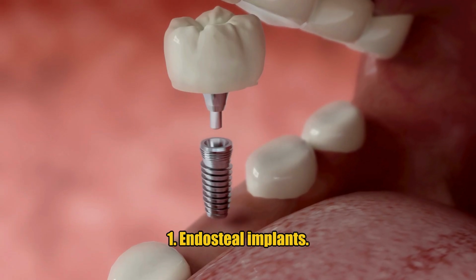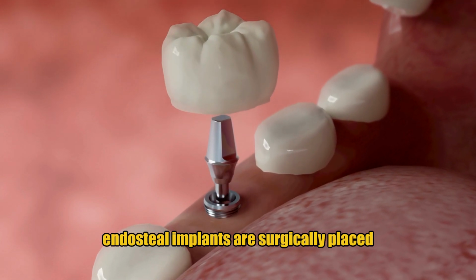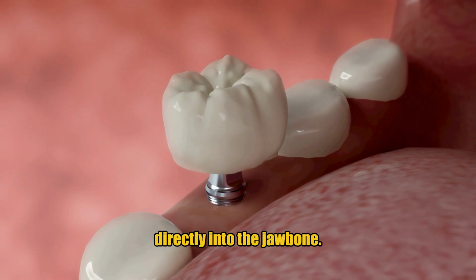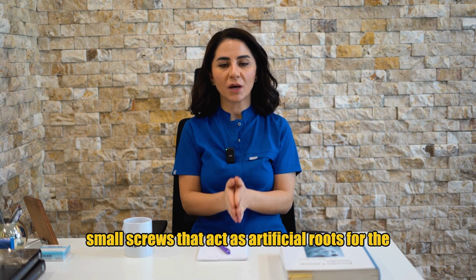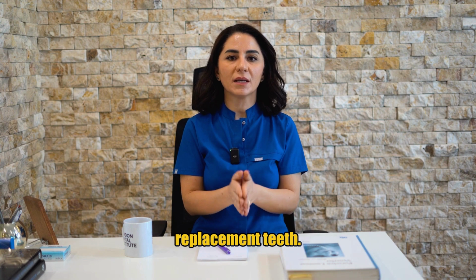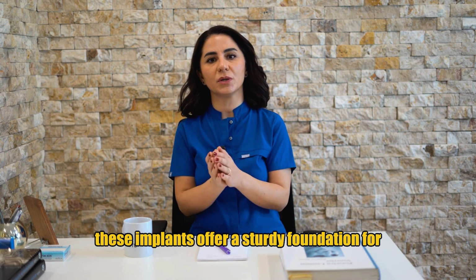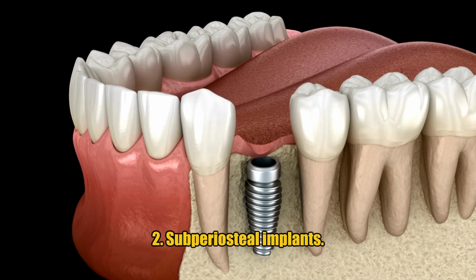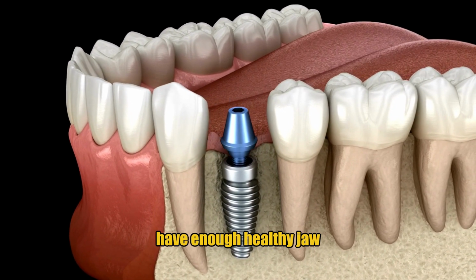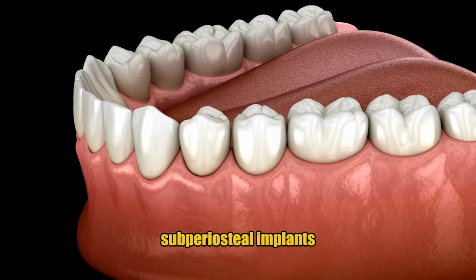1. Endosteal implants. As the most common type of dental implant, endosteal implants are surgically placed directly into the jawbone. They typically consist of titanium and resemble small screws that act as artificial roots for the replacement teeth. Ideal for patients with sufficient bone height, these implants offer a sturdy foundation for single crowns, bridges, or even full dentures.